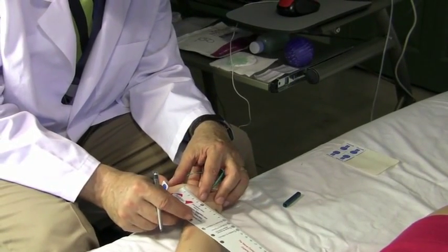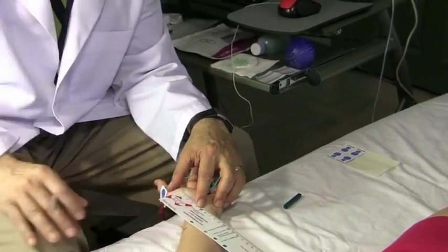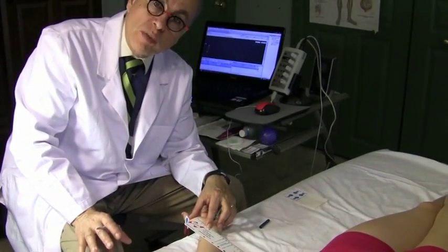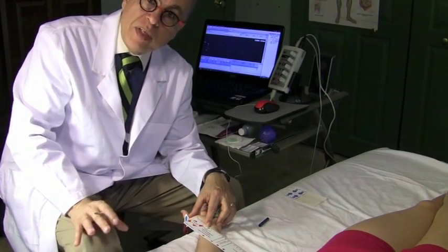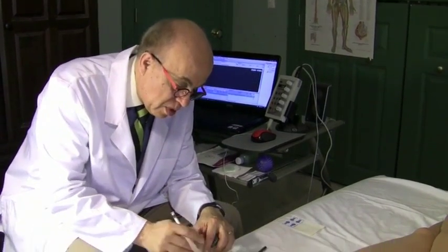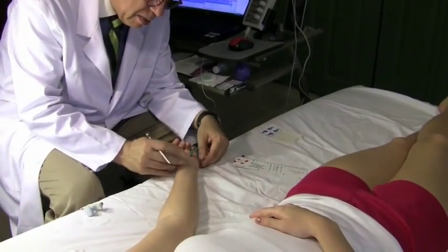Again, remember, it's not important what distance you measure as long as you measure it consistently the same as the one at which the normal values are obtained. If you've already been doing these studies and you measure those at 7 or 8, that's okay if you're comparing it to 7 or 8 normal values. It's okay. So I push here and I mark the 5 centimeter point.